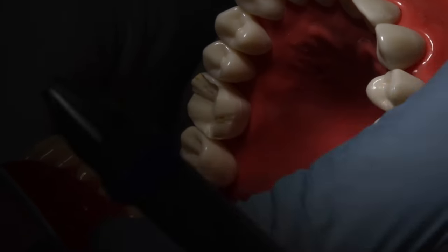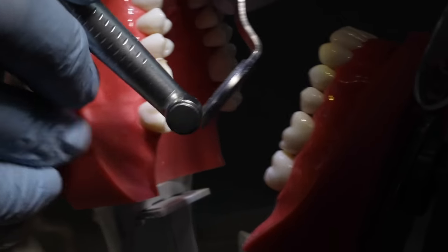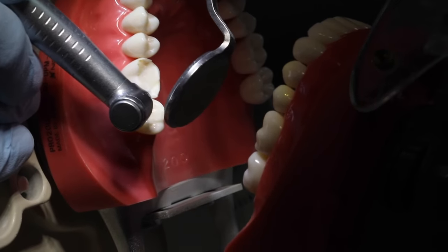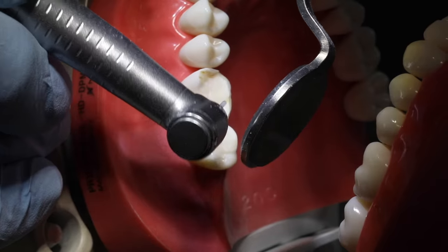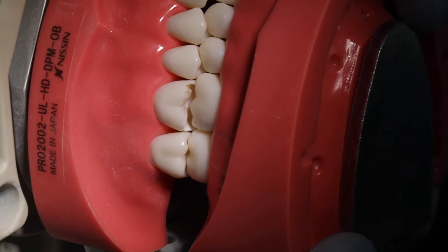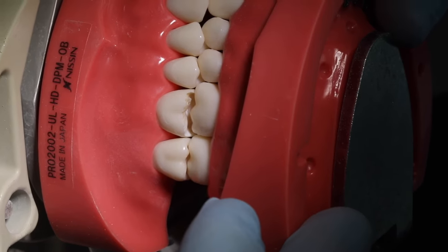So that's our rough occlusal reduction. Let's check ourselves and see that we're relatively uniform, which we are, a little bit closer toward the distal. So let's take a little bit more off in that area. Okay, so we've checked our occlusal clearance, and we reduced a little bit more toward the distal, where it seemed like it was still a little bit close, and it may still be that way. And when we do our final diamond finishing of that occlusal reduction, we'll refine that and pay attention there.